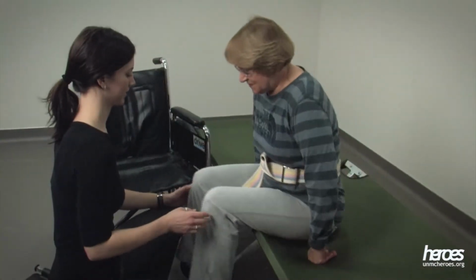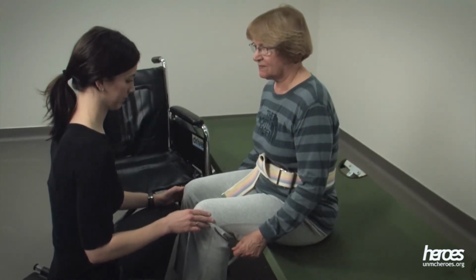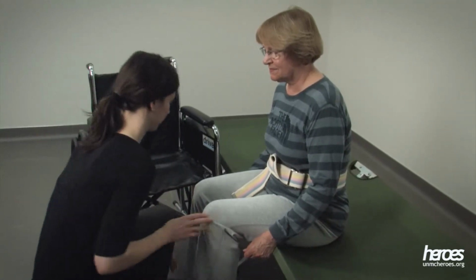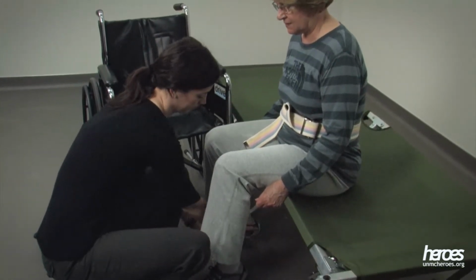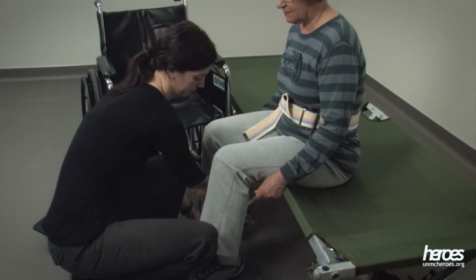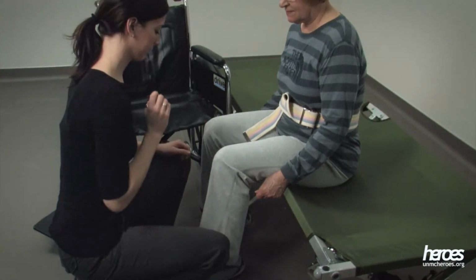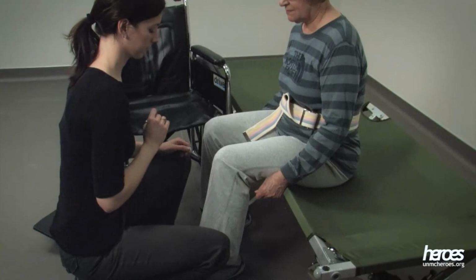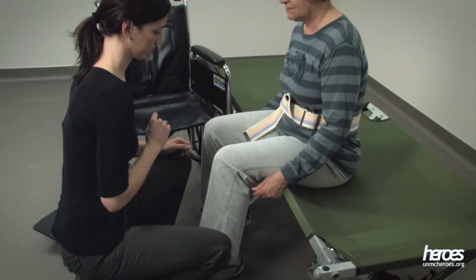Ask the individual to then scoot forward on the cot. Before standing, ask the individual if they have one leg that is stronger than the other leg. If they do, have the individual place the stronger leg slightly back and closer to the cot compared to their other leg. Both feet should be flat on the floor about shoulder width apart. This position allows the stronger leg to raise the body most effectively to a standing position. If the individual does not state having one leg stronger than the other, still use this leg positioning strategy.